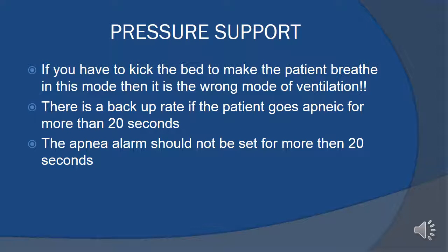And here's something that I've seen on a very regular basis, and I know a lot of people have seen this, and some of you listening to this video can definitely relate. The physicians are very excited to wean our patients off mechanical ventilation, and they insist that we should put the patient on pressure support even though they may not be fully awake. And they continue to go into backup ventilation.